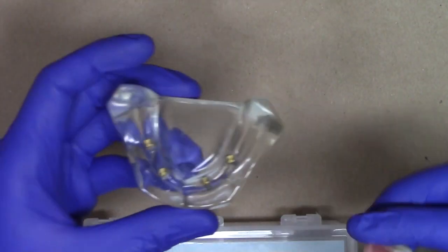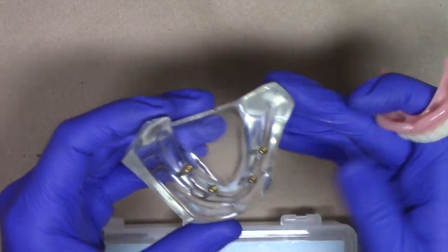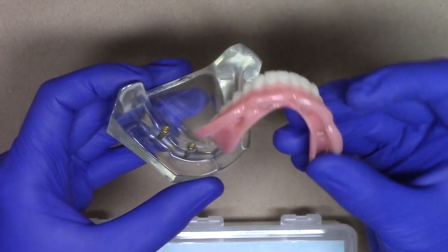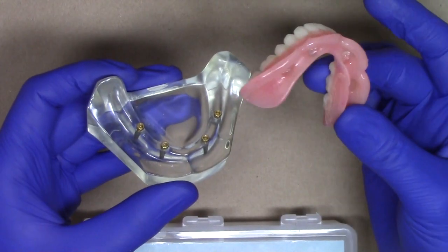And I'm going to describe our clinical technique of what we would like to do here. So imagine this situation where I just placed these 4 LODI implants on my patient. I have an existing complete denture. I've already initially done some of the hollowing out of the inside of the denture just to simplify the procedure.